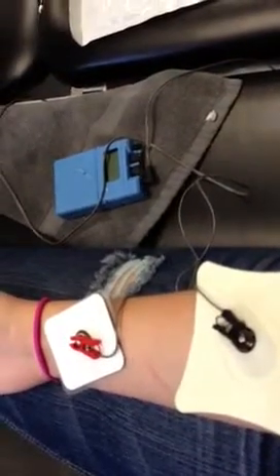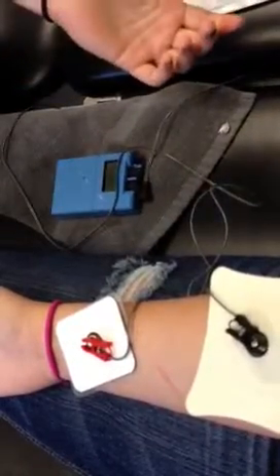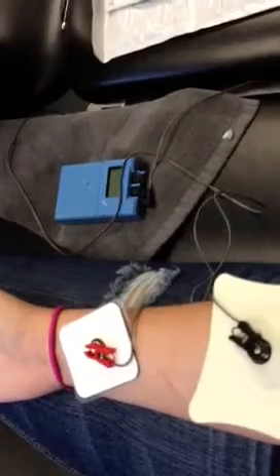Tell the patient what it's going to feel like. It should feel like a tingling sensation, kind of like a stim, but it shouldn't be anything painful. Make sure they know that if it is painful or they start to see any redness or anything out of the ordinary, they should tell you to stop the machine.